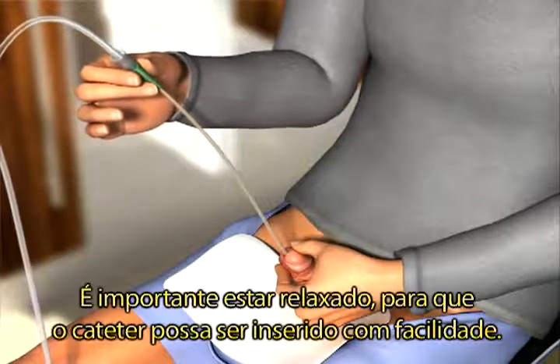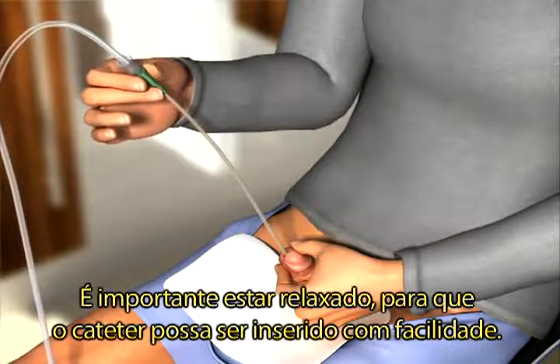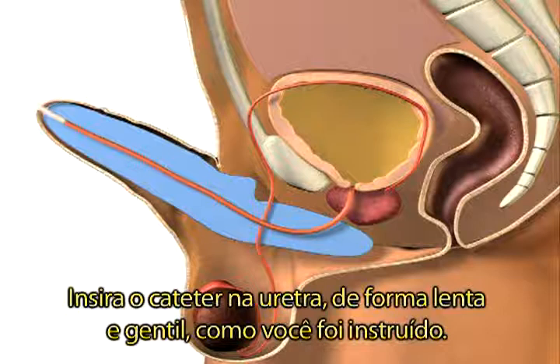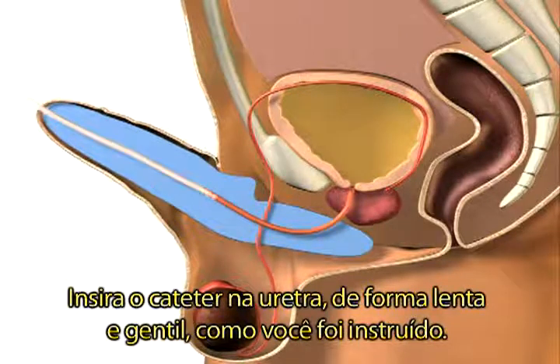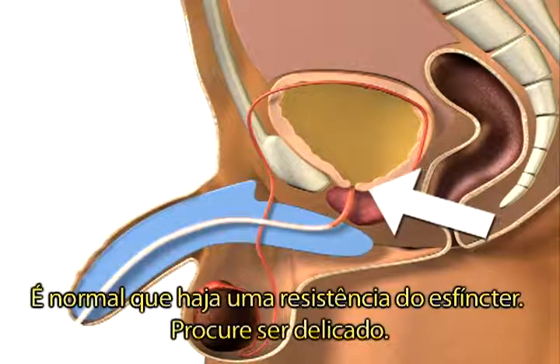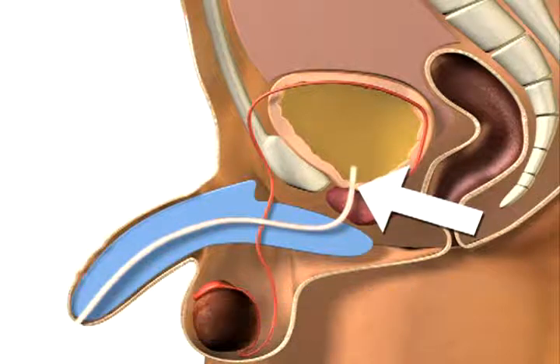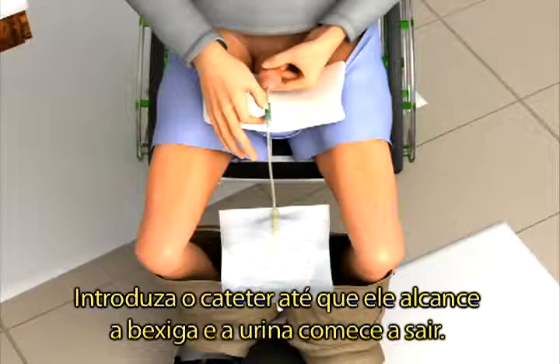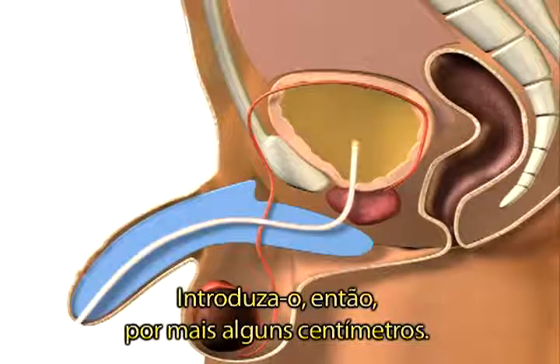To help insertion of the catheter, it is important that you relax. Slowly and gently insert the catheter into your urethra as you have been instructed. It is normal that you feel resistance from the sphincter, so be gentle. Continue to insert the catheter until it reaches your bladder and the urine starts to flow, then continue for a few centimetres further.